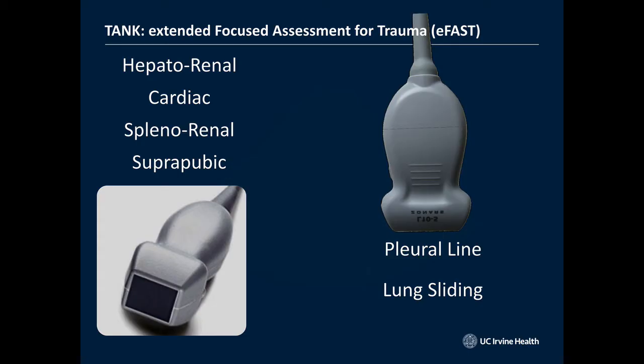Now, what about the eFAST? So, talk about the tank. Pump, tank, pipes. We're in the tank right now. We got through the IVC. Now we're talking about the FAST exam. The FAST exam is hepatorenal and cardiac, which we already did, so we're going to skip that.